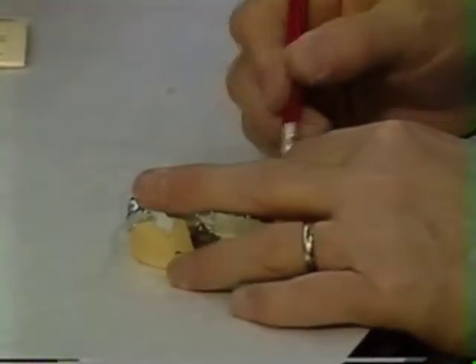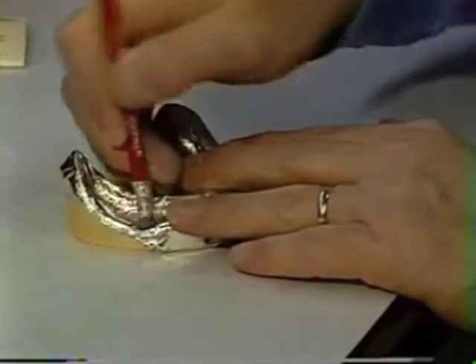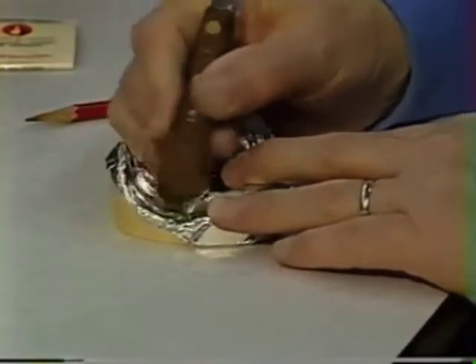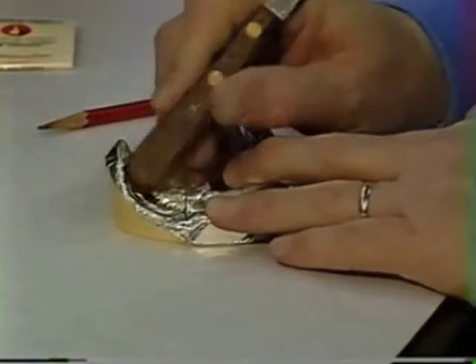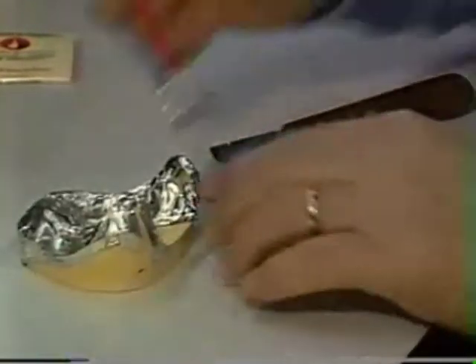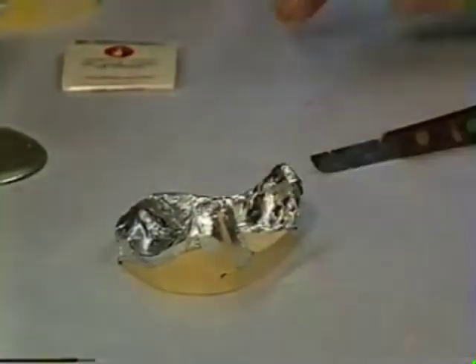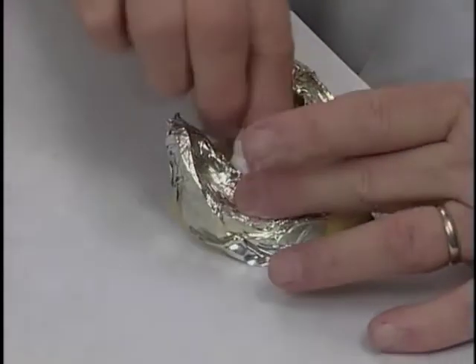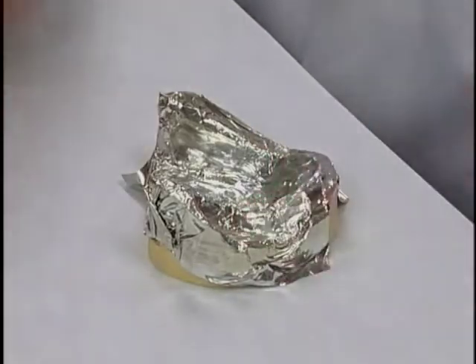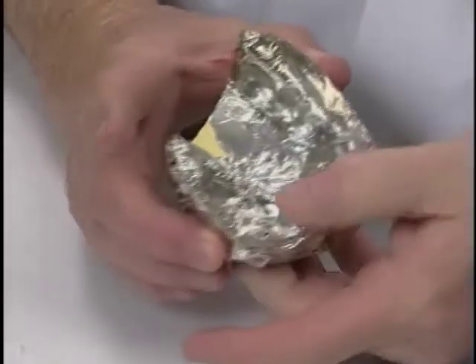And if you get wrinkles again, use an eraser. We'll use a wooden handle of a knife. You could use a tongue blade or a cotton roll. All of those things will work as a burnishing agent for the tinfoil. Just make sure it is well adapted. Now we have all of our tinfoil burnished in fairly well, so that it is about as smooth as you're going to get it.